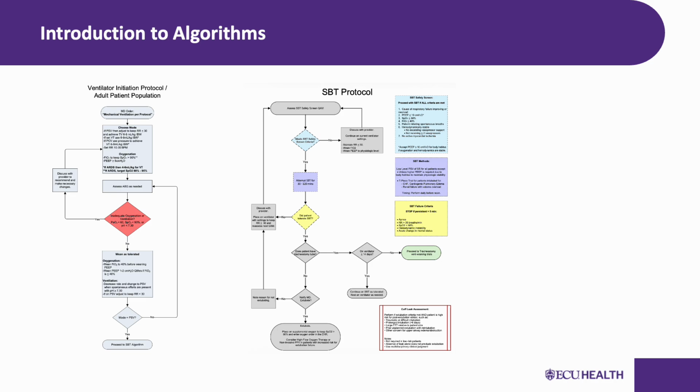I'm going to walk you through each decision point in detail so you will not be left guessing. But having this visual framework in your mind will help everything click into place as we go. Think of it like reading a map. Once you know that blue lines are rivers and red lines are highways, navigating gets a lot easier. All right, with that orientation out of the way, let us get into the meat of it. Up next is an overview of all five of our active mechanical ventilation protocols, and then we will dive into each one individually.